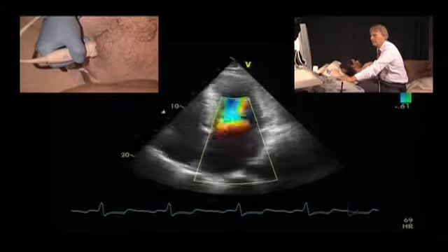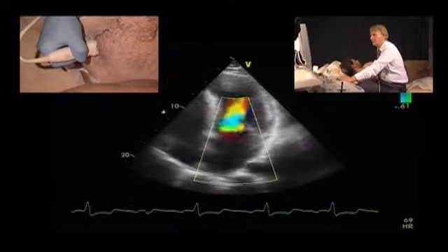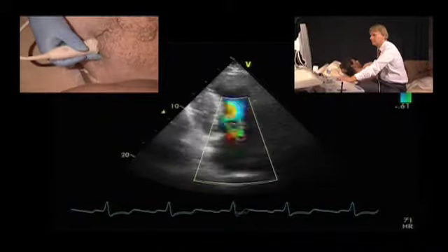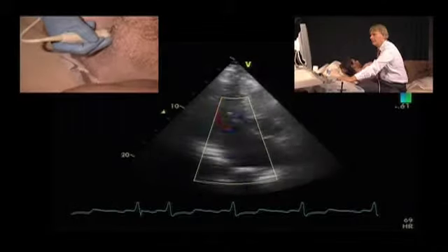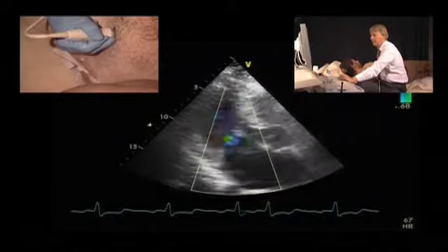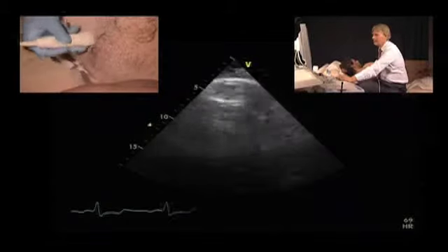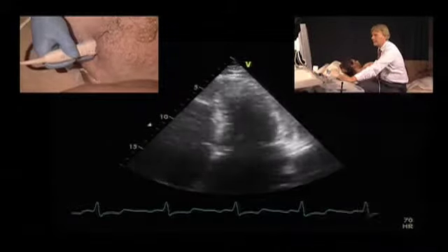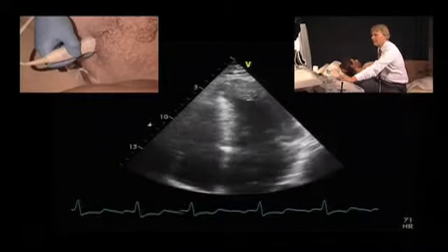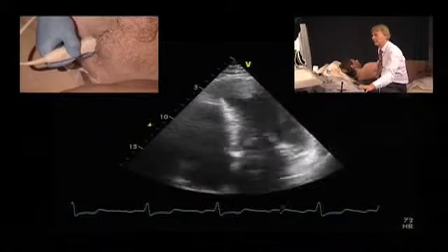This is the 4-chamber view. Very difficult to here really visualize the vena contracta or the proximal acceleration of the jet. But in summary, if we look at all the views, regurgitation is probably moderate. It is sometimes difficult to assess the LVOT velocity because of this regurgitant jet. Sometimes we can mistake the LVOT velocity for the continuous wave velocity of the mitral regurgitation.